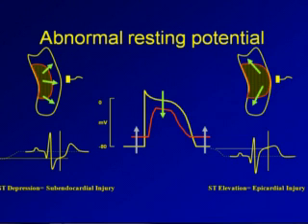What happens then, since we don't have a true zero recording, and all we're seeing is this part of the QRS, is it's going to look like the ST segment has been shifted downward. When in fact, the truth is, everything else has actually been shifted upward, and the ST segment's the guy who's telling us the true zero point. Now that's a terrible oversimplification, but it makes it fairly easy to understand.